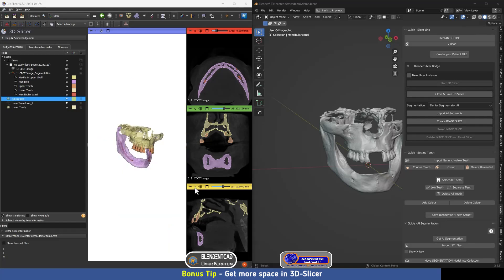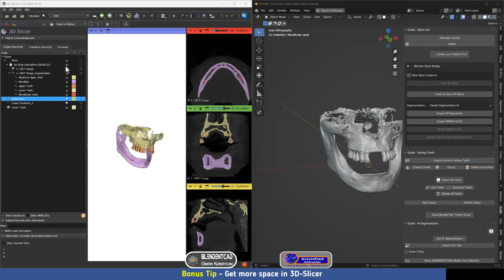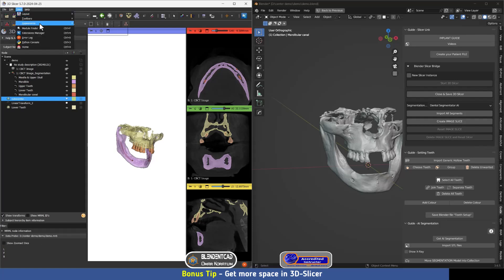Bonus tip: if you want more room for the 3D view and slices in 3D Slicer, you can remove the module panel by going to View, Appearance, and then clicking Show Module Panel to disable it.